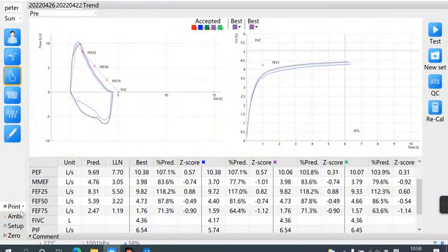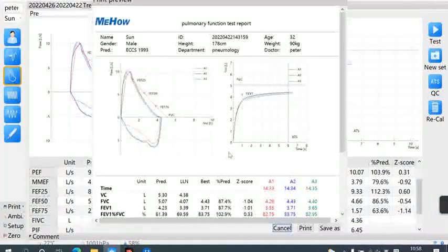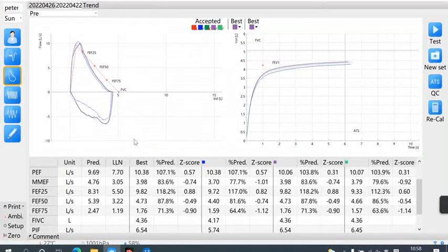Like printing the history report directly, click the drop-down menu next to Printing. Select History Report and Print Preview. To view the changed report results, click Print. The historical report can be printed directly, and the report printing and modification are completed. End of presentation.